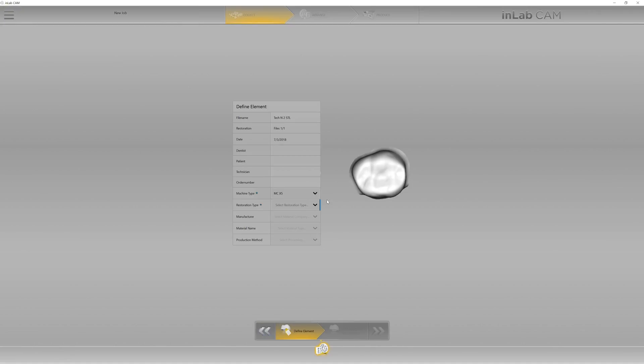Now we're not quite done yet. We have to fill in a little bit of information whether it's the dentist, patient name, technician, order number. You feel free to add what you want to add there. Machine type will already be designated from the type of job we chose earlier.